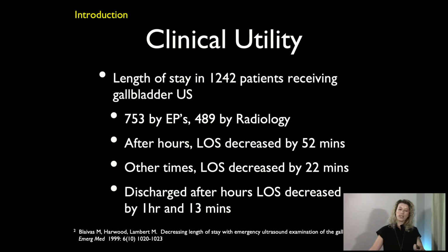So essentially this says that length of stay is decreased. I said that a couple of slides ago. Emergency physicians, once they have training, are really good at finding gallbladders, and they're really good at finding gallbladder pathology. So in emergency departments where you don't have 24 hours of formal radiology available, it will decrease length of stay. This is kind of an older study, but significantly by minutes, hours, and for patients, that's huge amounts of time.